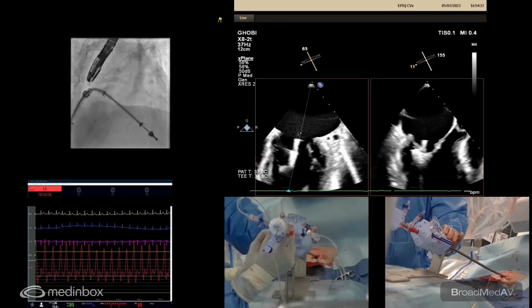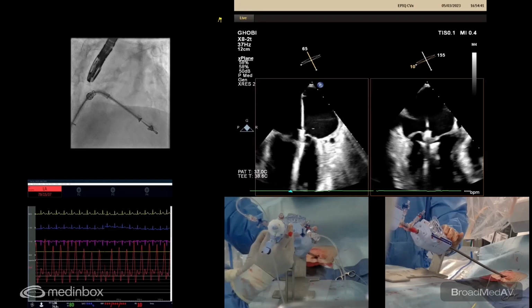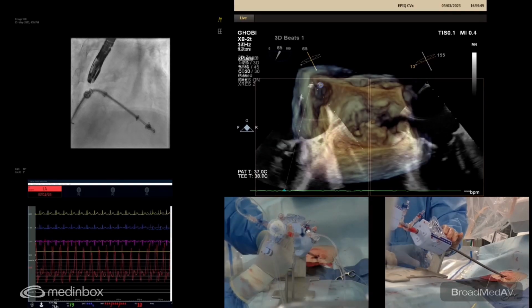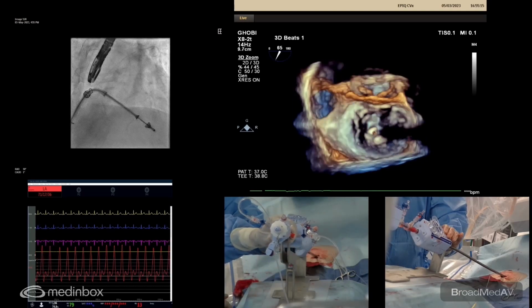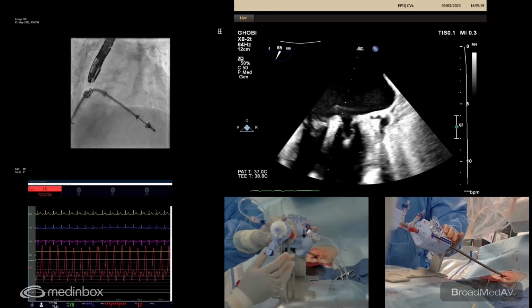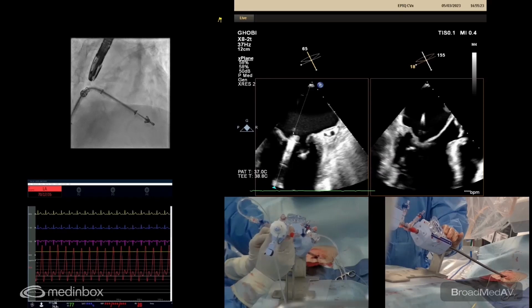Okay. I'm just going to go a little bit more medial. There you go. I think I should take this. Yeah, I think you got it there. So I think this is kind of where our original grasp was. Yes, this is a very good position. Okay. Let's take this. Correct? Do you want to go slightly more medial? No. I want to take the lateral part because now I'm going to lateralize it. You know what I'm saying? Yep.